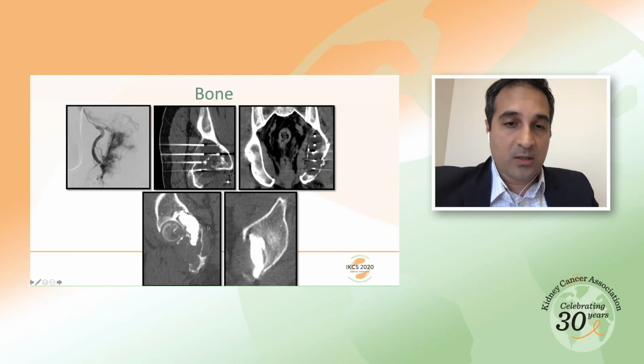Following cryoablation, we then delivered bone cement right along the portion of the tumor that's involved in the acetabulum to help with the weight-bearing status.